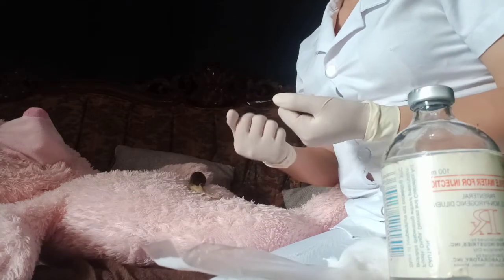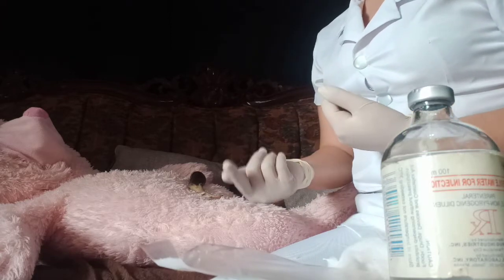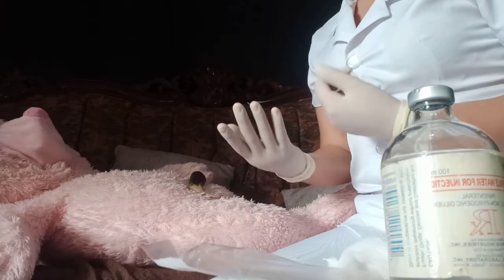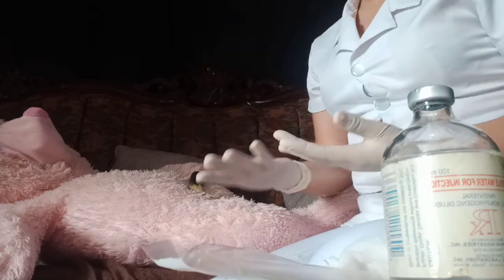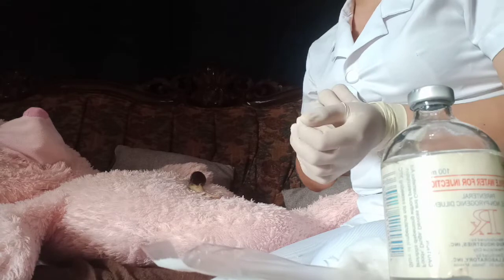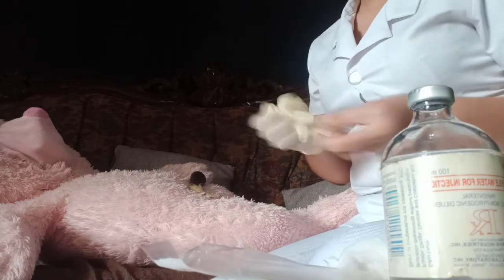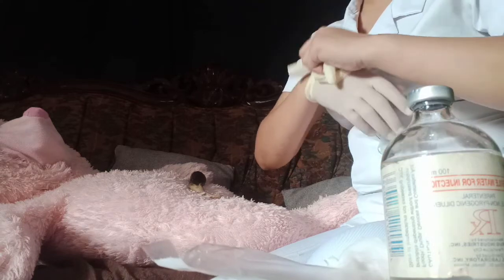Remove the gloves. Dispose of used items in the appropriate receptacle. Return other equipment. Then perform hand hygiene. Then assess the effectiveness of the medication at the time it is expected to take effect. So now I'm done with hand hygiene.